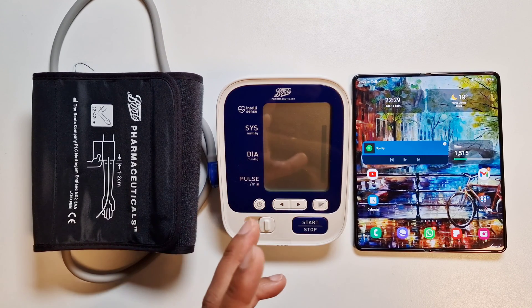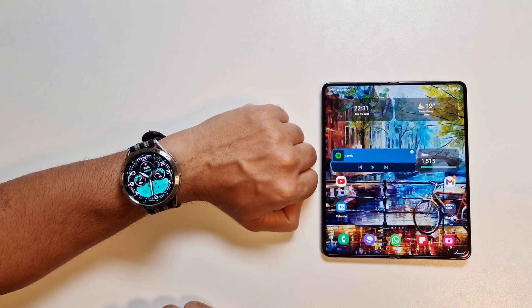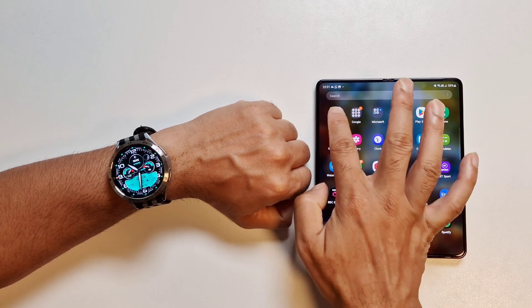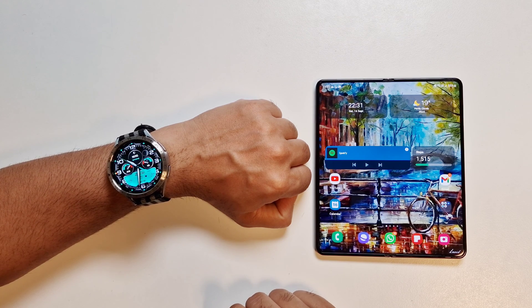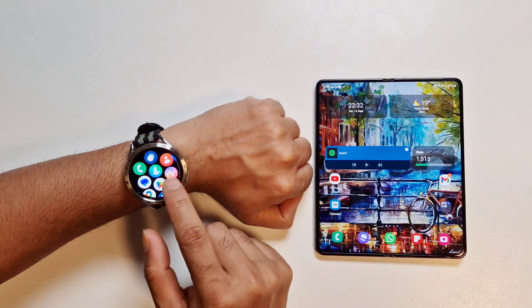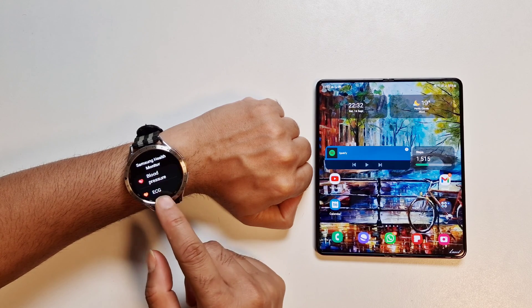We'll move the medical device out of the way because we need to start with the watch and phone. The watch comes with the app pre-installed, but the Samsung Health Monitoring app you have to install on your phone. If you don't have it, once you start using your watch it will prompt you to download it. On your watch, open Samsung Health Monitor and under that you've got Blood Pressure.